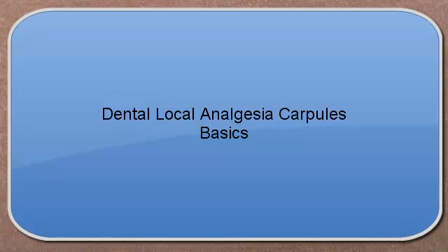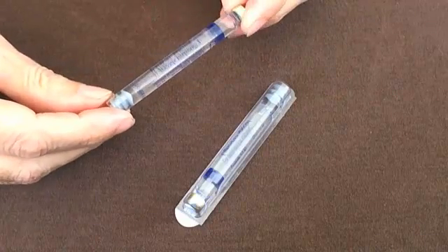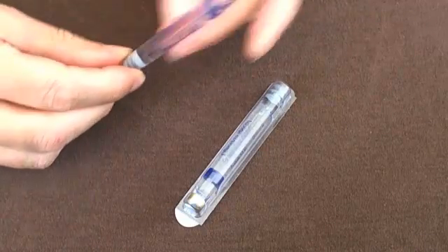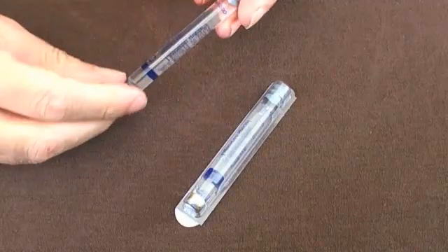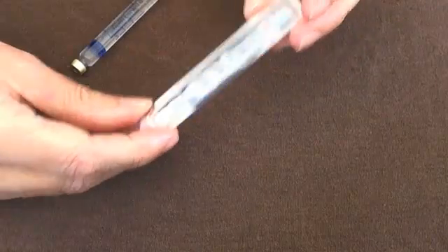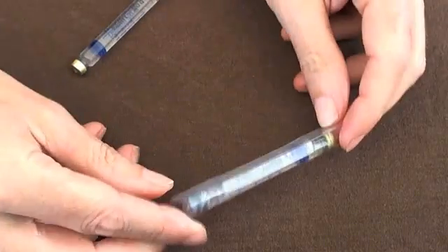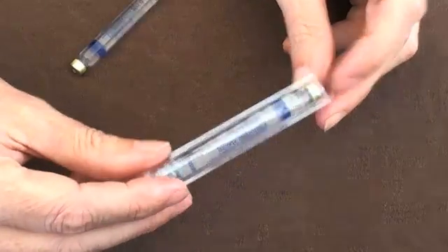Hello and welcome. Today we're going to spend a couple of minutes talking about carpules. Carpules are the way that local anaesthetic solution is produced and provided for dental use. Carpules always come sealed in a plastic wrap, and this is where I've cut one carpule away from the plastic wrap so you can just see one on its own.